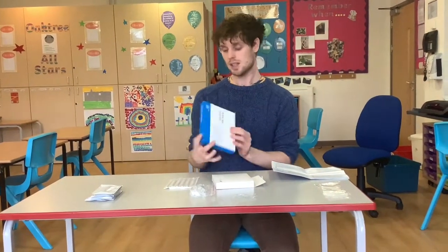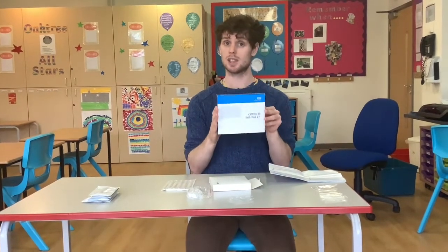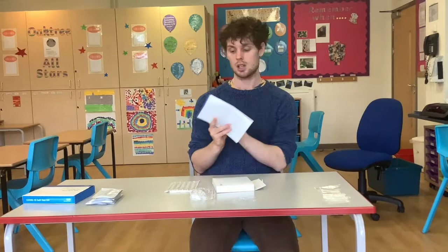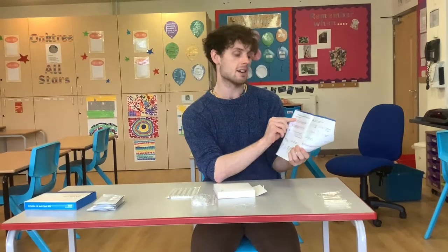Hi guys, I'm just going to talk you through how to take your COVID tests at home. Your test kit box will look like this, and inside, the first thing you want to do is turn to this step-by-step guide for COVID testing in the box. Step one says prepare your test area and check your test kit contents, so we're just going to do that first.